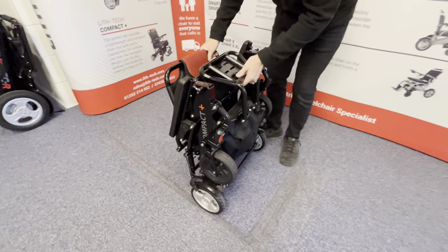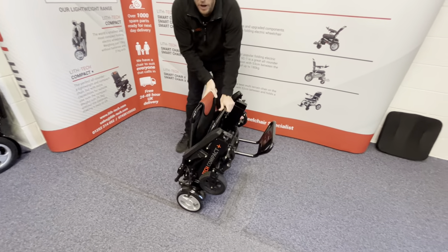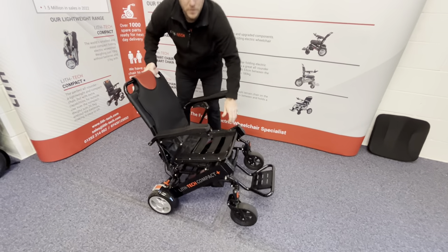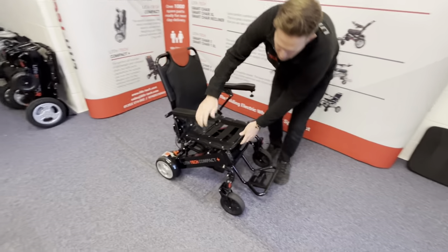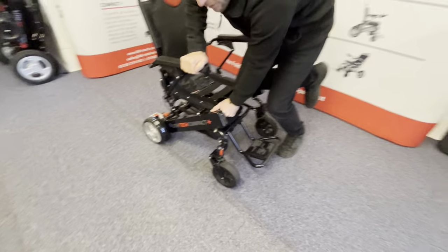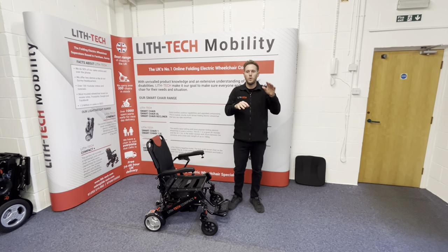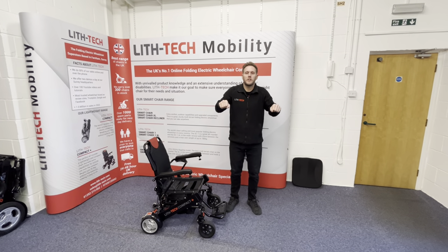I'll show you this now and open it up for you. To open it up from the side, we separate our hands and snap. You can actually see when I push this frame down, you can see those shocks working. Whenever you're going over any bumps, they're actively moving all the time which is going to keep you more comfortable.